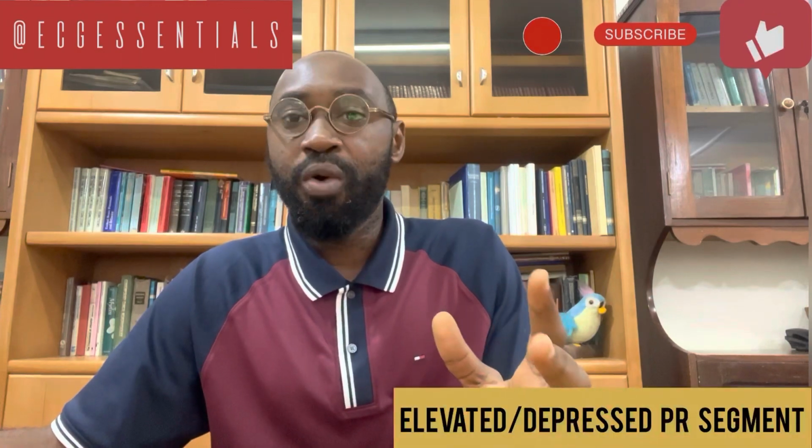All right. Although usually our interest is in the PR interval, whether it's prolonged or shortened, another interesting thing we need to pay attention to is the PR segment, whether it is elevated or depressed.